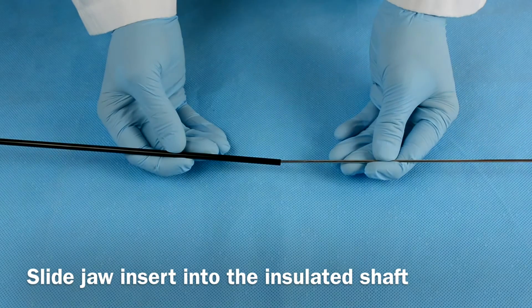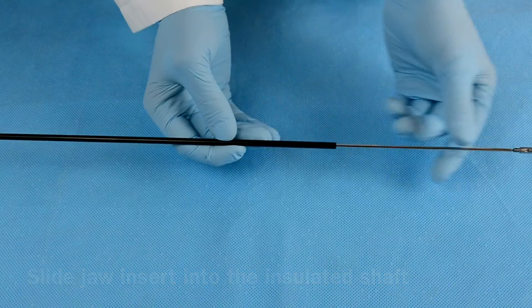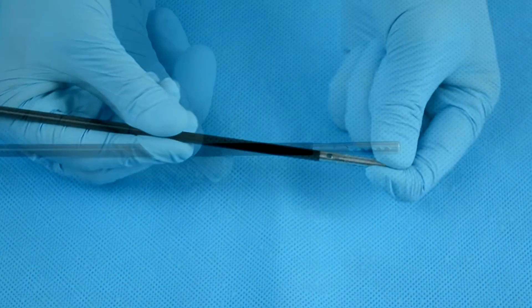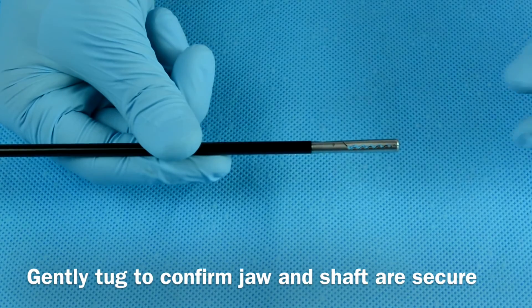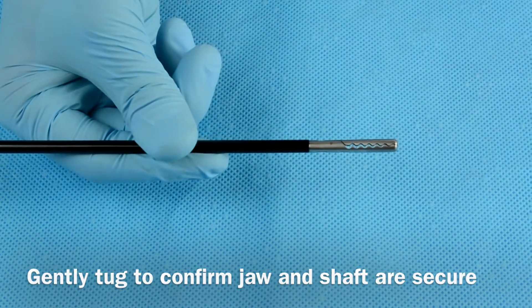To assemble the precise instrument, slide the jaw insert into the insulated shaft. Hold the jaw as you thread the shaft clockwise. Confirm assembly by gently tugging on the jaw and the shaft. Both pieces should be secured into place.